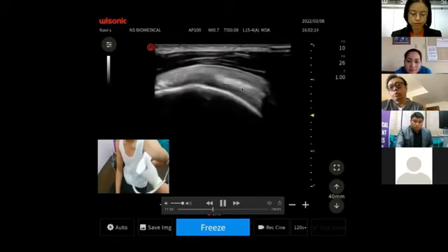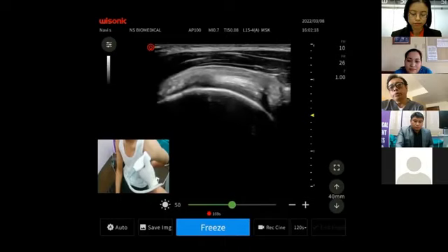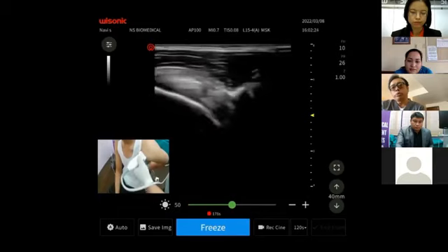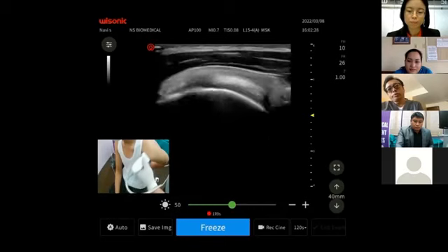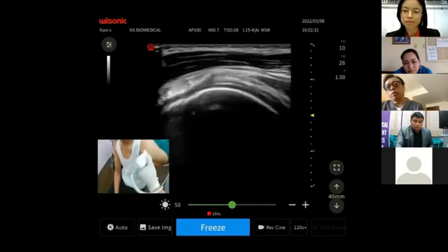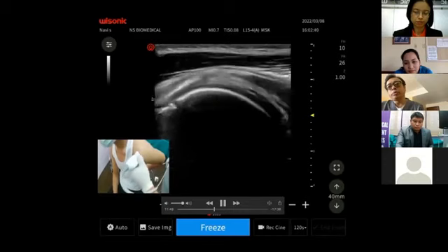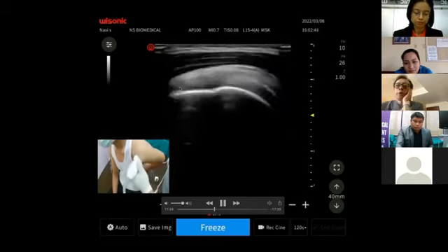After counting our layers, we have to scan the supraspinatus muscle and tendon in the whole of it. So we scan it superiorly to inferiorly, anteriorly to posteriorly, all the way. And as we scan the supraspinatus muscle posteriorly, here we can see the infraspinatus tendon coming into the picture, and both of them, the supraspinatus as well as the infraspinatus, go on and insert to the greater tuberosity.